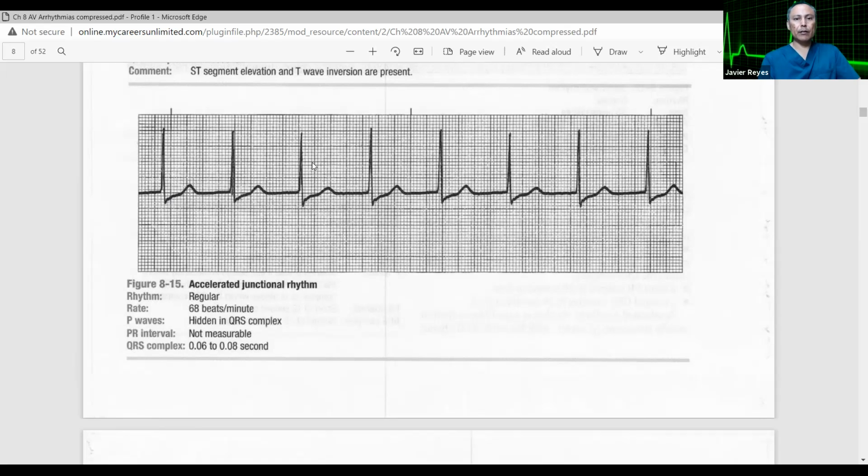And the heart rate, we see it's about 80 beats per minute, more or less. It says 68 here, but it looks like 80 around there. Oh, you count this. I'm sorry. The 3 marks start here, so you count here. 1, 2, 3, 4, 5, 6, 7. So about 70. It says 68 here.